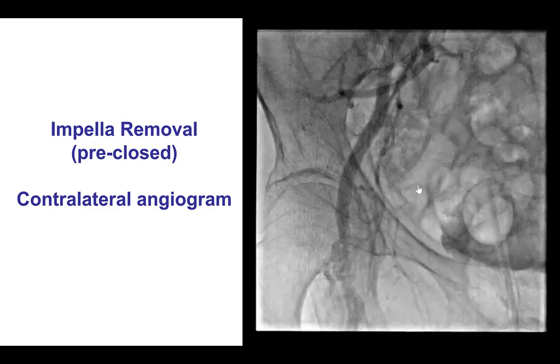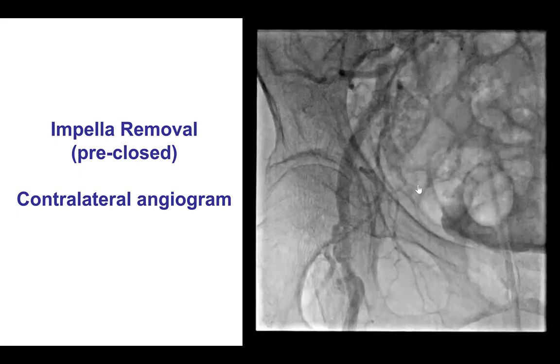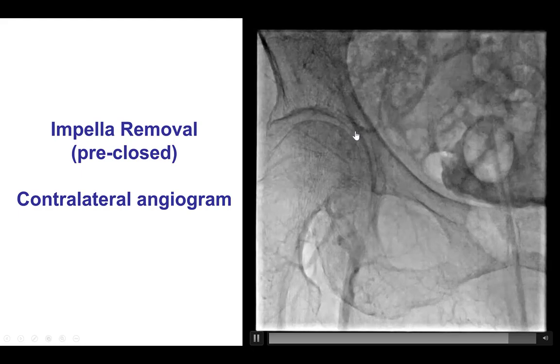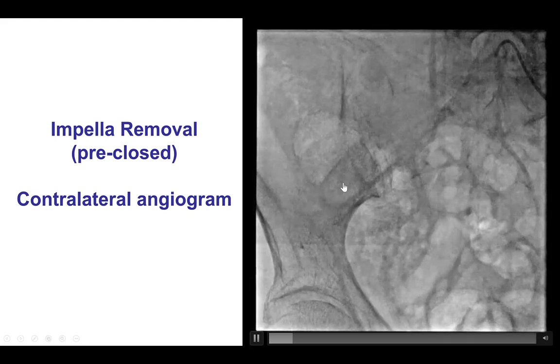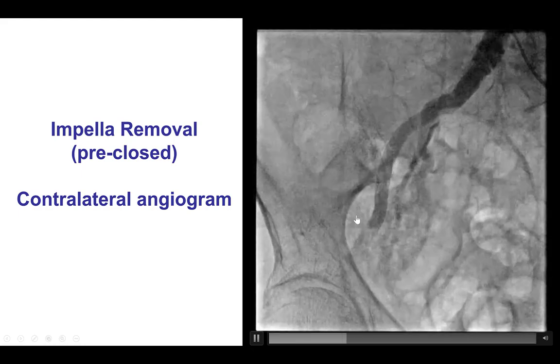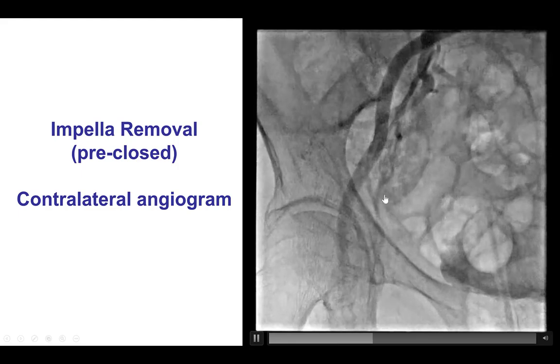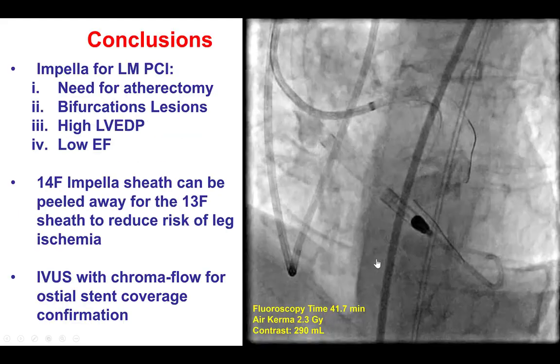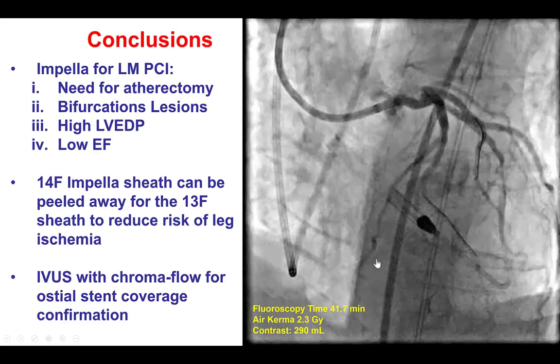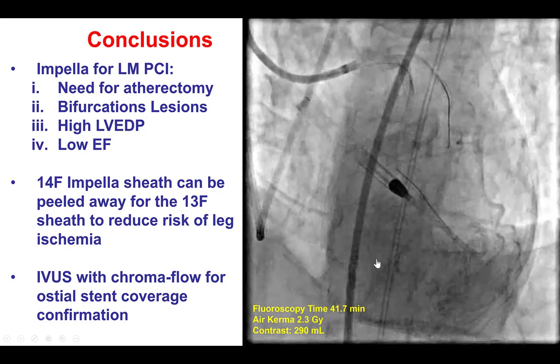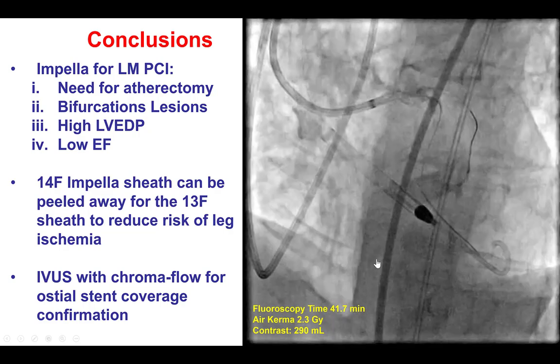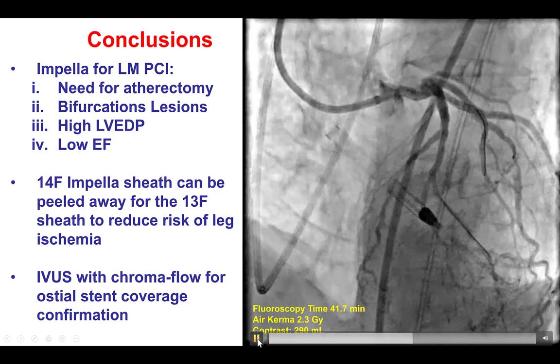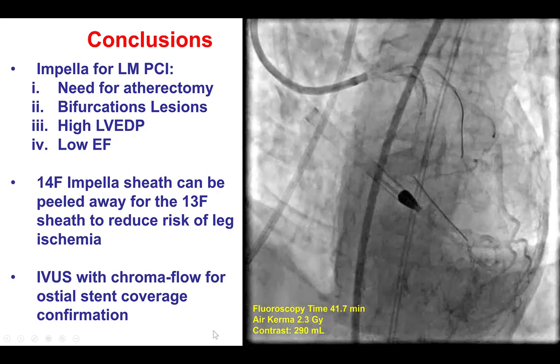The patient remained stable throughout the procedure. We then removed the Impella. We had placed two Perclose sutures prior to inserting the Impella sheath, and those were then tightened. We had a contralateral injection showing good hemostasis. This was the final result — we had good flow from the left main into the LAD, ramus, and circumflex, and the patient did well.